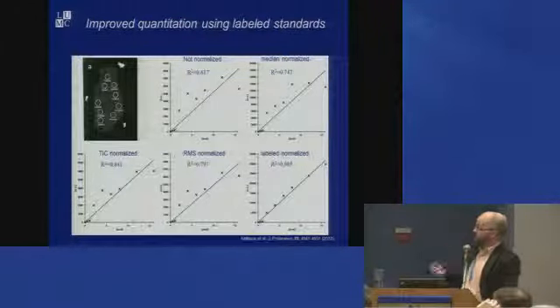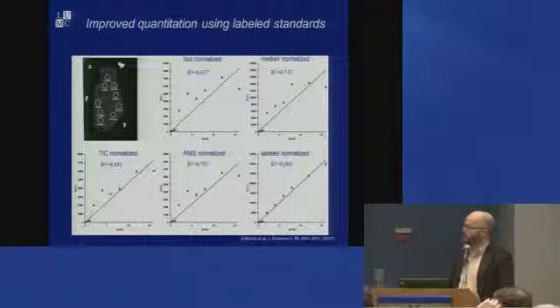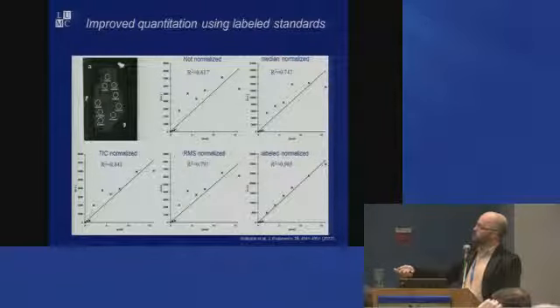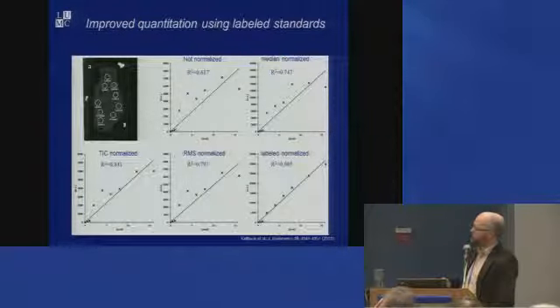Improved quantitation, well, it seems a little bit mundane to say it now. We've heard a lot of people saying you need isotopically labeled reference standards for proper quantitation. This is also the same in imaging mass spectrometry. In this case, it was a drug deposited onto some lung tissue. Here we see the raw data. This is just a dilution series. And if you see this, you'd say, okay, there is a vague pattern there, but it's not overly great.